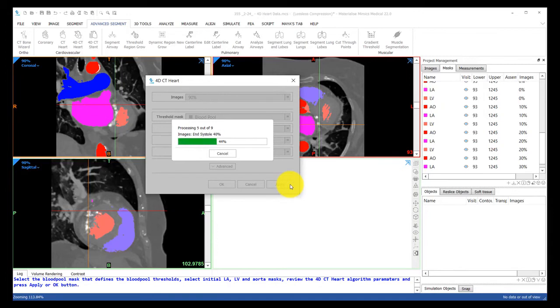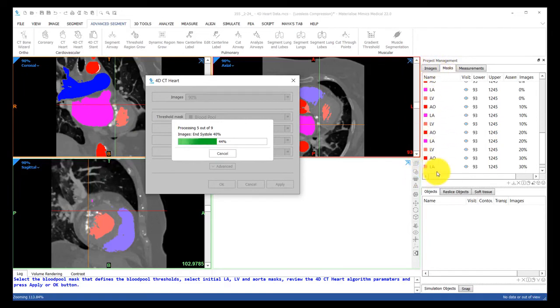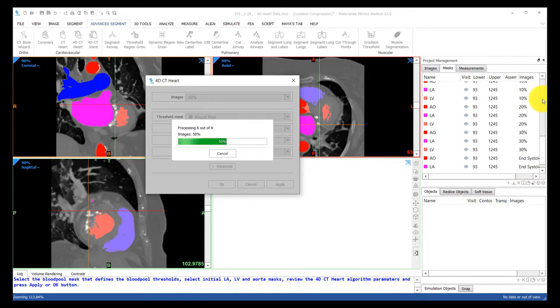As the tool goes from scan to scan segmenting these heart chambers, you will find their masks populate here on the right, as well as an indication of which scan the mask is associated with.